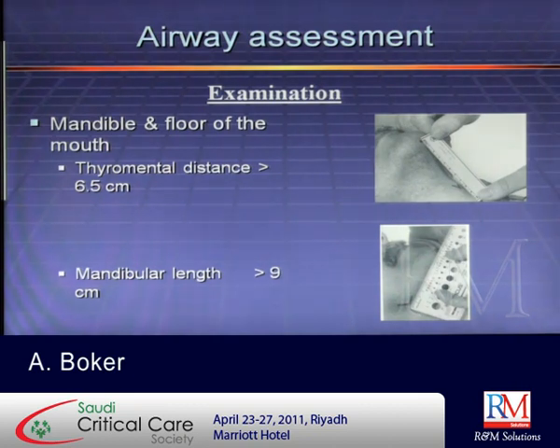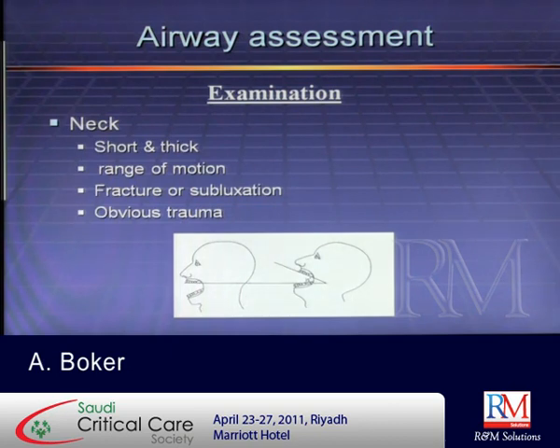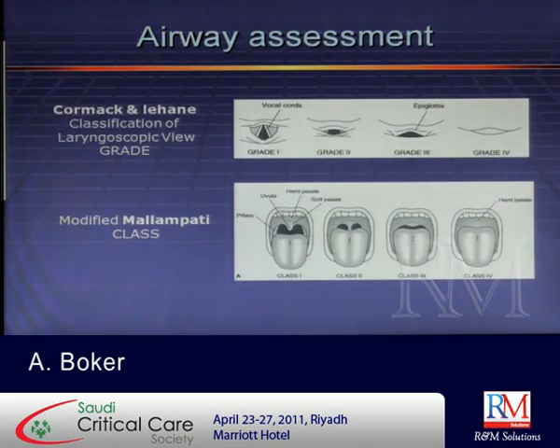So examination, other features for difficult airway. Then the neck movements. This is the laryngoscopic view. This is, you know, the nickname for this, Mallampati scoring. And then this is the laryngoscopic view. Is this something useful? Very useful. Okay. Yes, raise your hand. No, raise your hand. Okay, it's yes and no.